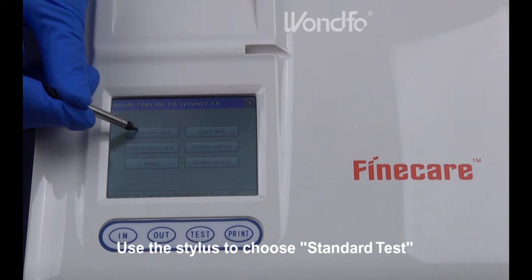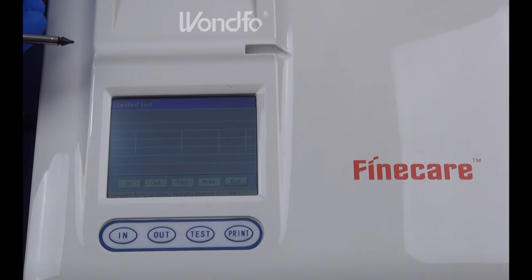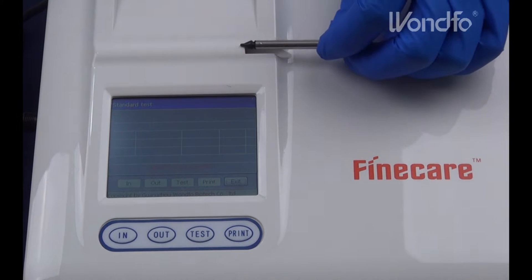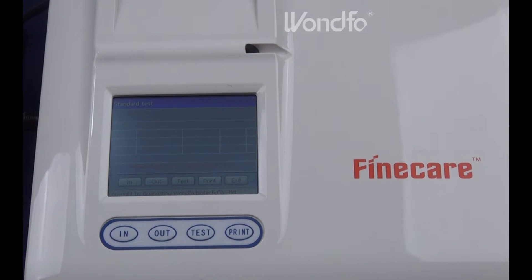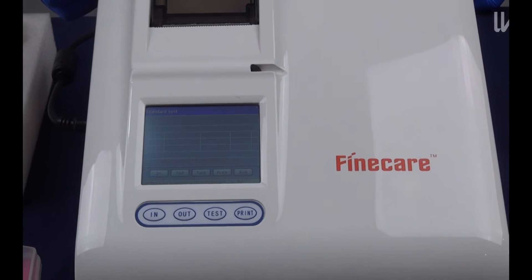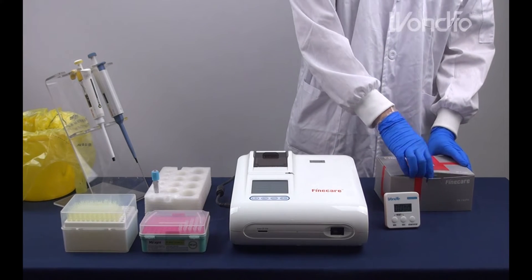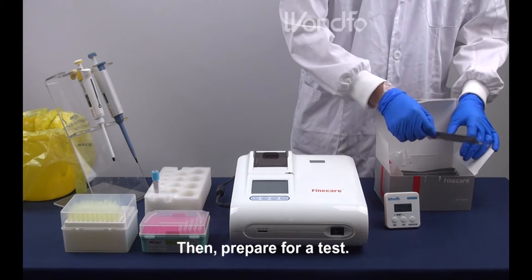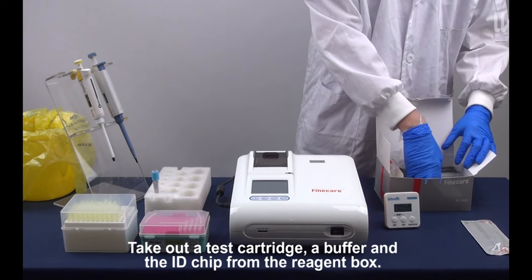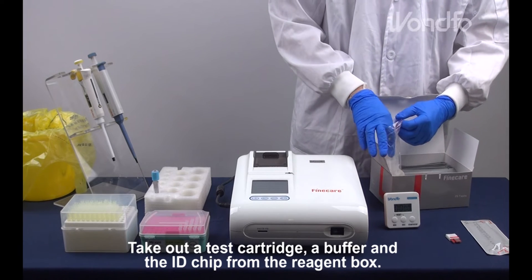Use the stylus to choose standard test. Then, prepare for a test. Take out a test cartridge, a buffer and the ID chip from the reagent box.